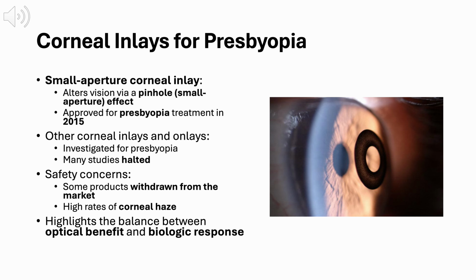Now, let's shift to corneal inlays for presbyopia, which take a very different approach. The most well-known example is the small aperture corneal inlay. Rather than reshaping the cornea, this device works through a pinhole effect, increasing depth of focus and improving near vision. This approach was approved for presbyopia treatment in 2015.